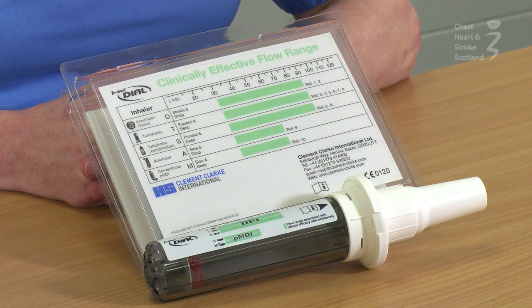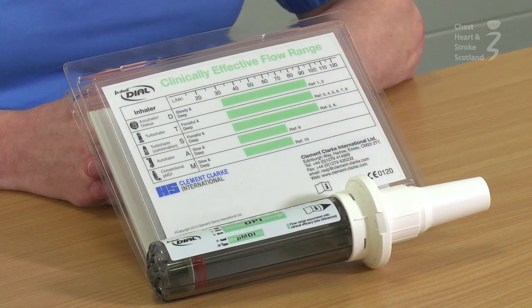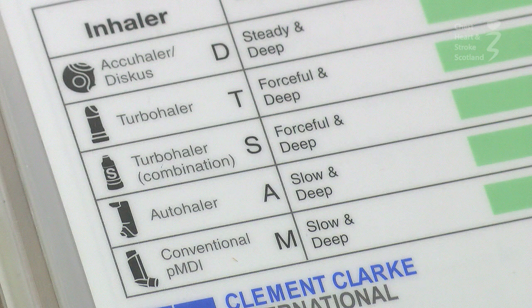This is the InCheck dial. It is used to measure whether a patient has enough inspiratory flow to activate any of the devices listed on the front.